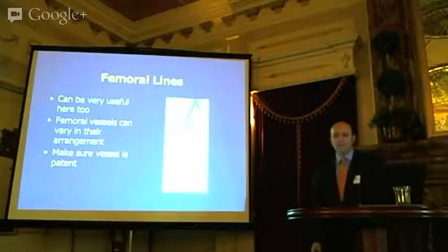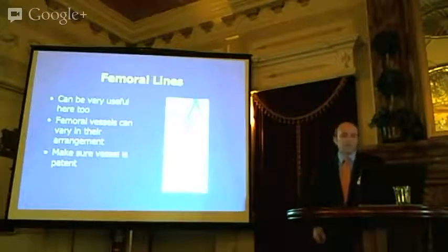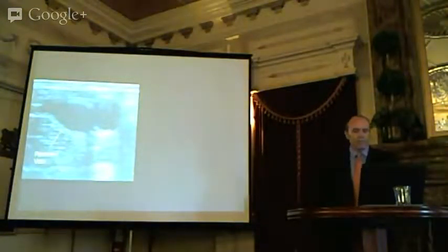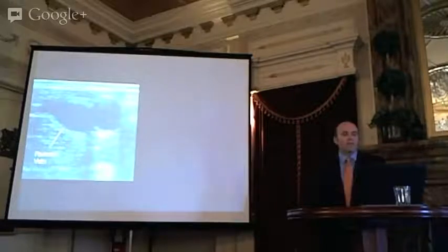I always acknowledge the limitations. Plus, if you can get the definitive line at that time, I think you can do it. If you can't get a line of any type, I agree, IO is a great backup. And when it does go bad, you can figure that out on ultrasound because you're feeding fluids into the muscles. It's a great tool, but in certain settings, I just think ultrasound by and large trumps it. And now that you have very good video guides, you can probably do the femoral or whatever line even faster, even if it's a tough approach.